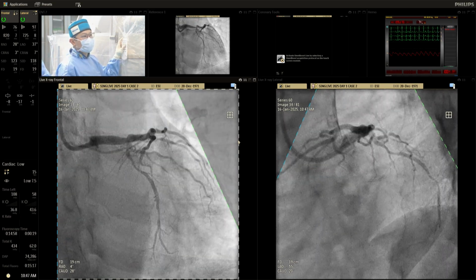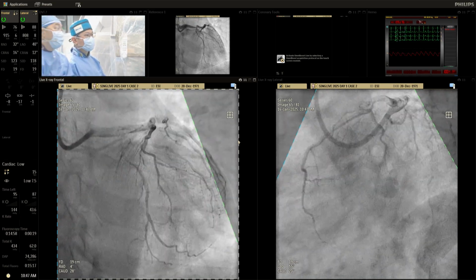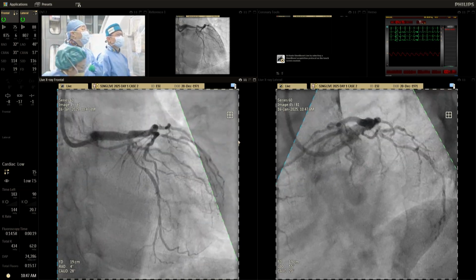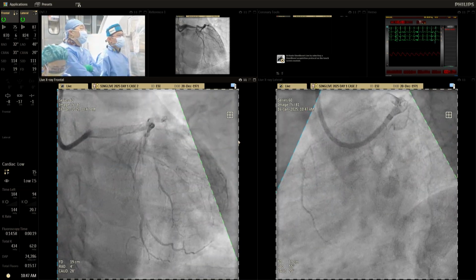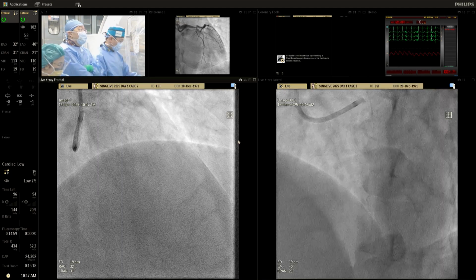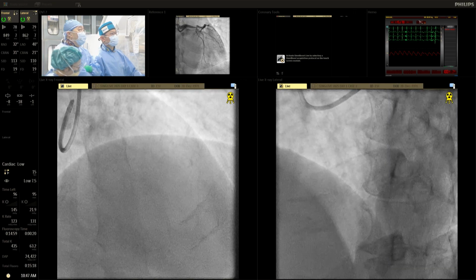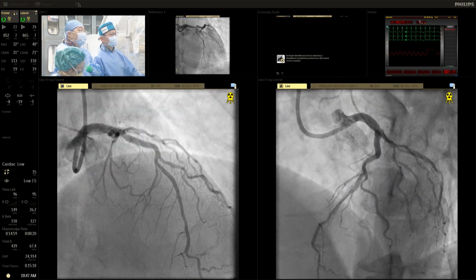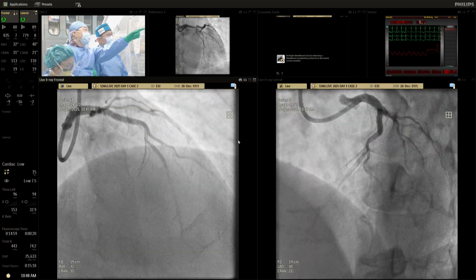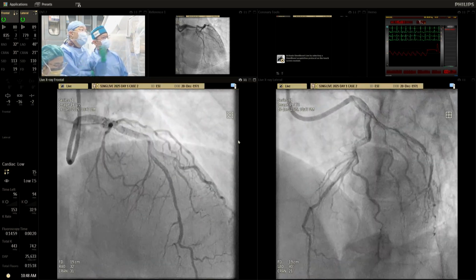So obviously, angiographically not so satisfying in this field, but I'm just thinking what other things we could have done to make the expansion better. I'm not so sure whether IVL or atherectomy would help. It's very eccentric. This view looks like the expansion is quite good on this cranial view.